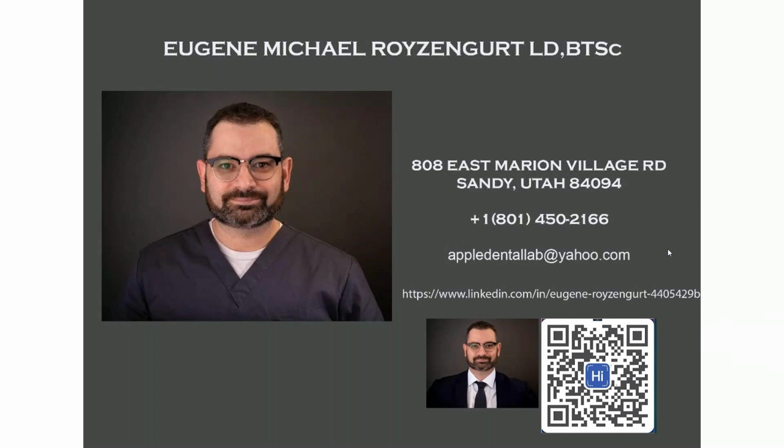It matters case by case, but two of the main things that we generally do, if we're doing a screw retain, I really like to do screw retain on multi-units, because even though it takes up a little bit more room, because you need room for components, right? If you're not going straight from implant level, you need room for the multi-units and so on. It really allows you to correct some divergence on the implants, on the implant level, and you correct it with abutments. And also, if you're having some issues with fracturing and stuff like this, you can always just replace the abutment without having to worry about messing up the implant.